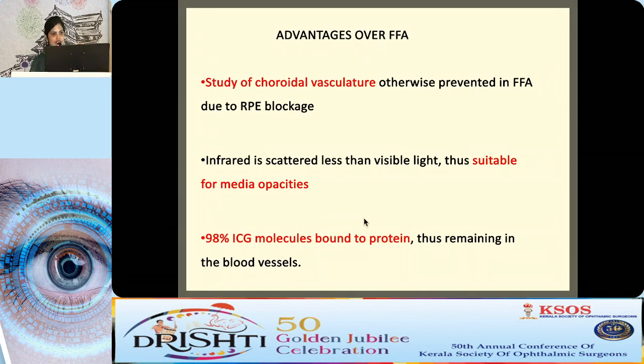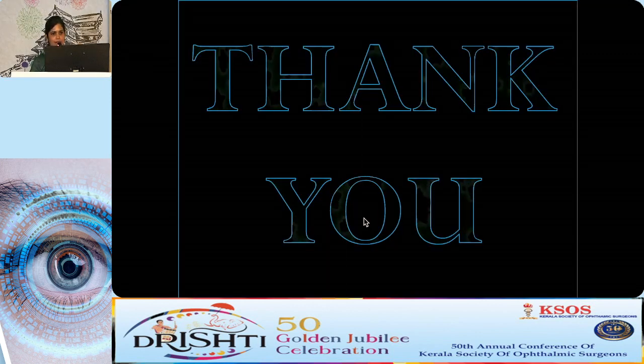Advantages over FFA: study of the choroidal vasculature, otherwise prevented in FFA due to RPE blockage. Infrared is scattered less than visible light, and thus is suitable in media opacities. And ICG is 98% protein bound, so it remains in the blood vessels for a longer time. Thank you.